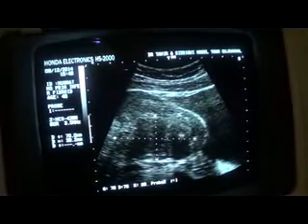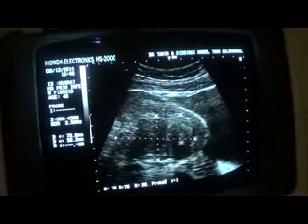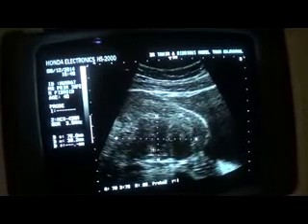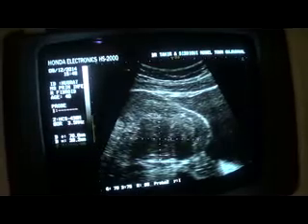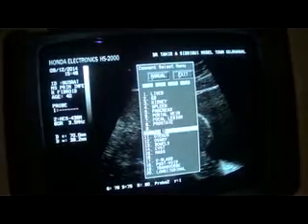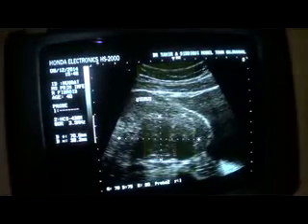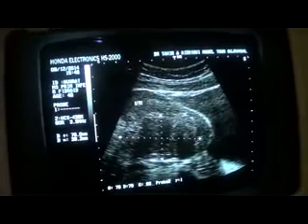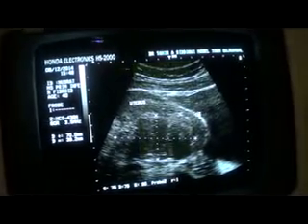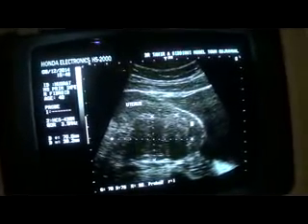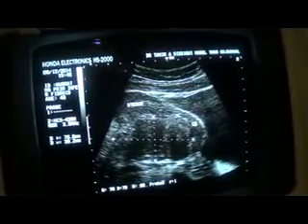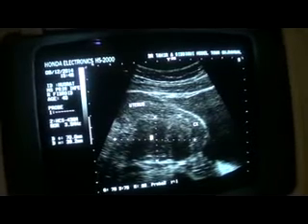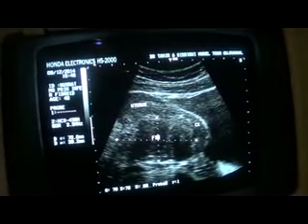It's an echogenic mass and it gives posterior shadowing. These are shadows within it. This is the uterus, anterior myometrium, and this is the cervix being elevated by this fibroid. This is a fibroid, in fact.